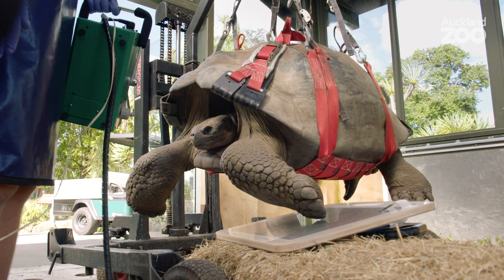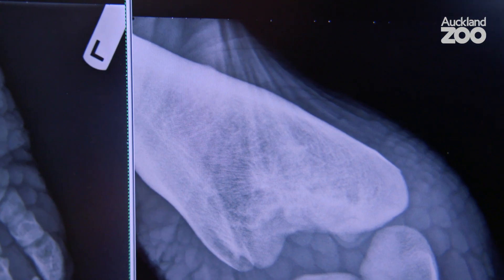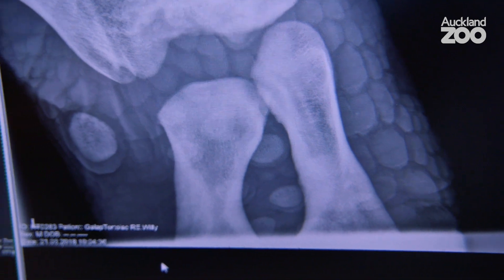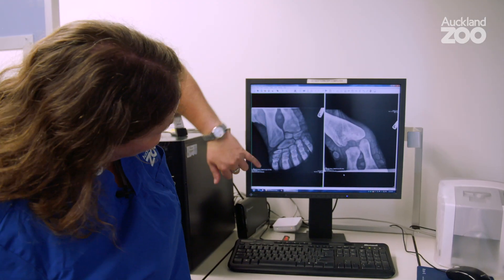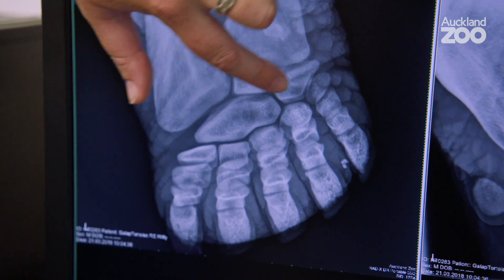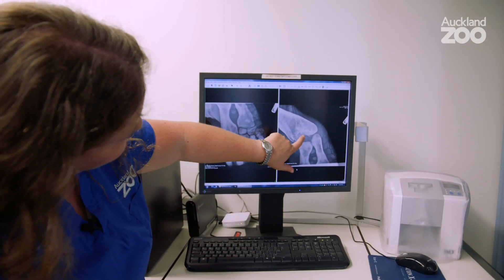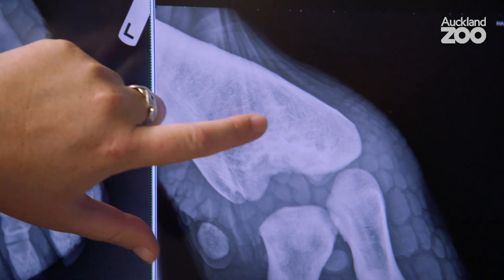So the x-rays that we got from today — we're now back at the vet hospital and we can look at those on a bigger computer screen. You can see all of those bones. He's also got that really thick skin, so you can actually see the surface of the skin, all those little toes, and then these are the carpals — his wrist — and then his elbow joint, and then the top bone, the humerus.